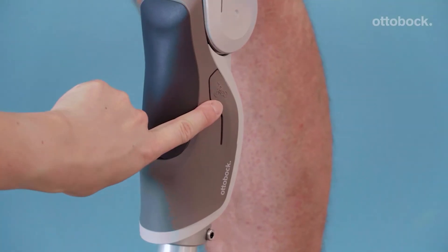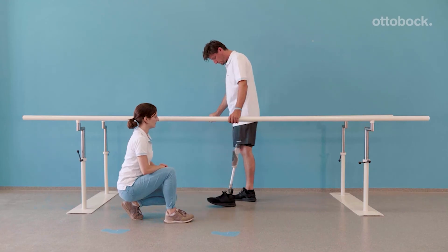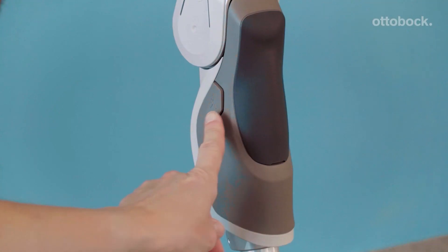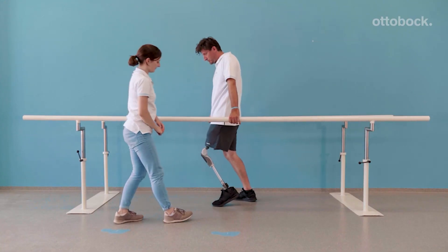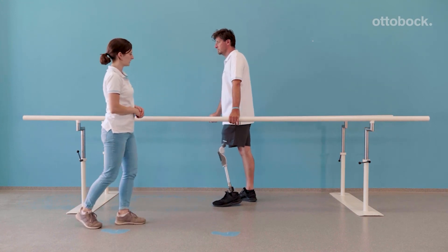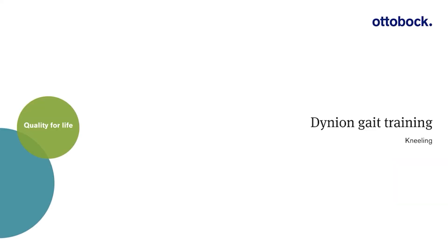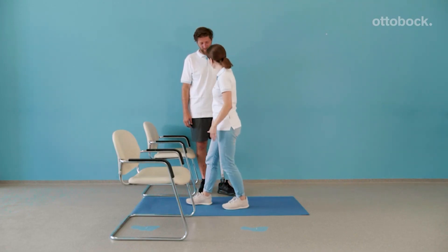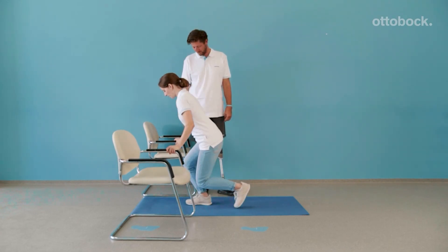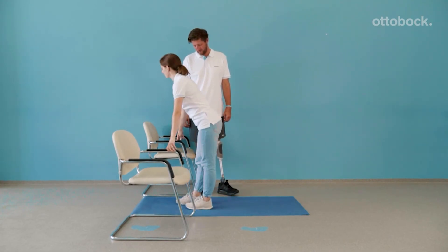To understand the free swing characteristics of the bicycle mode, try first between the parallel bars. To use the bicycle mode, activate only when you are on a bicycle and remember to deactivate before you start walking again. This mode is only for riding a bicycle. With the 3R85, kneeling is possible using the hydraulic resistance. The shown method is only one example and variations can also be trained.